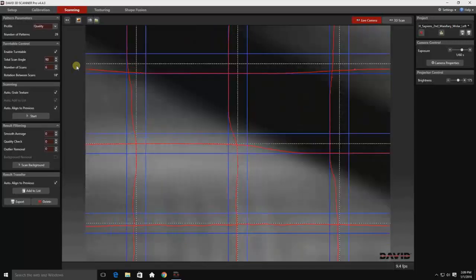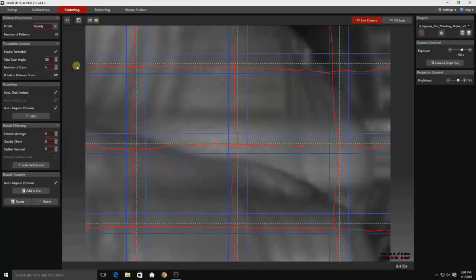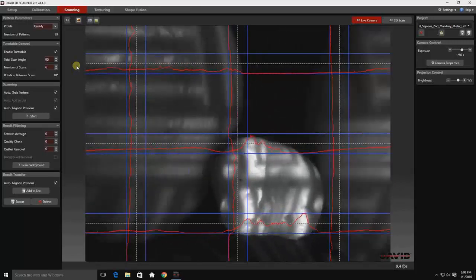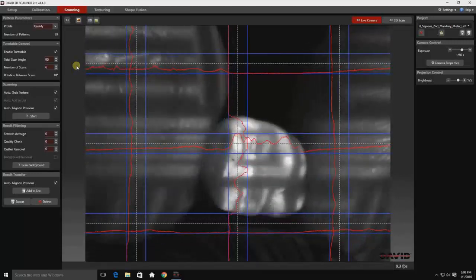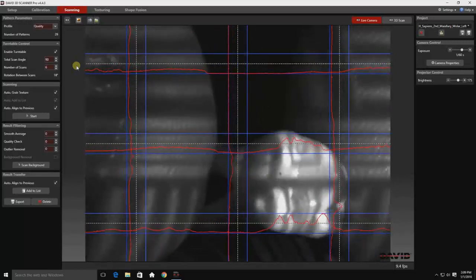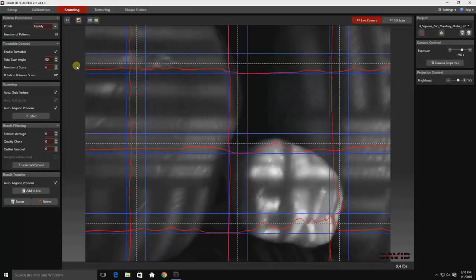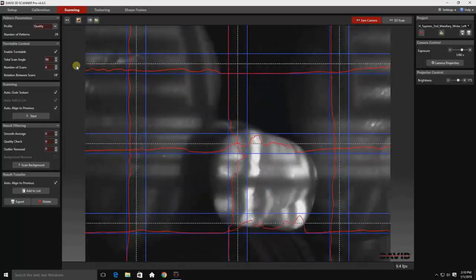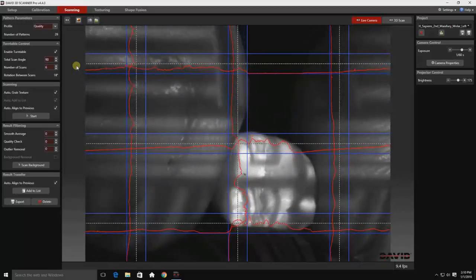Now I'm working on repositioning the tooth on the clay. You need to make sure that the front of your object is right at the y-axis point on the table. If you have the object too close to where the y-axis is set behind the area you're looking, you're going to create a significant amount of foreshortening. The tooth is going to sweep very far from left to right, and it's going to give you very bizarre results.